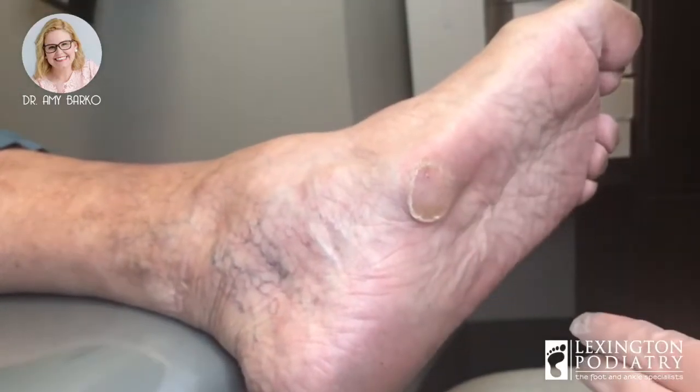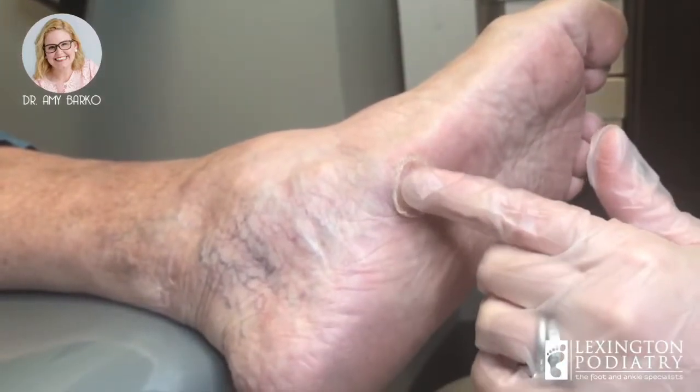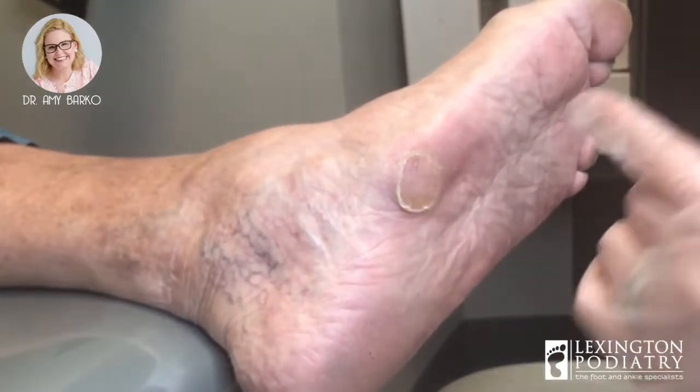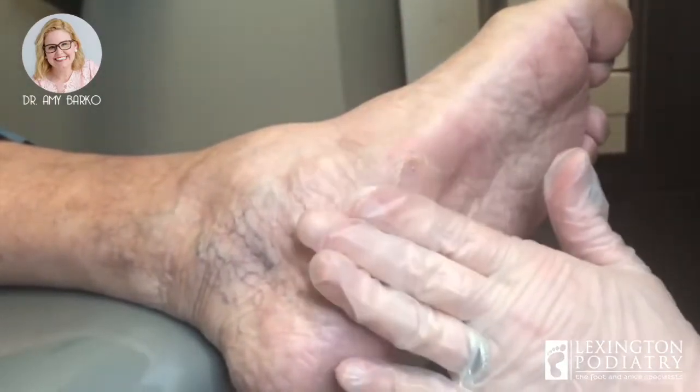Calluses help with pain. Sometimes they cause pain, but sometimes they help with pain. So I'm down to normal skin. I don't want to make her bleed because then that does cause pain. So my goal here is to get her to a comfortable place and then we smooth her down.